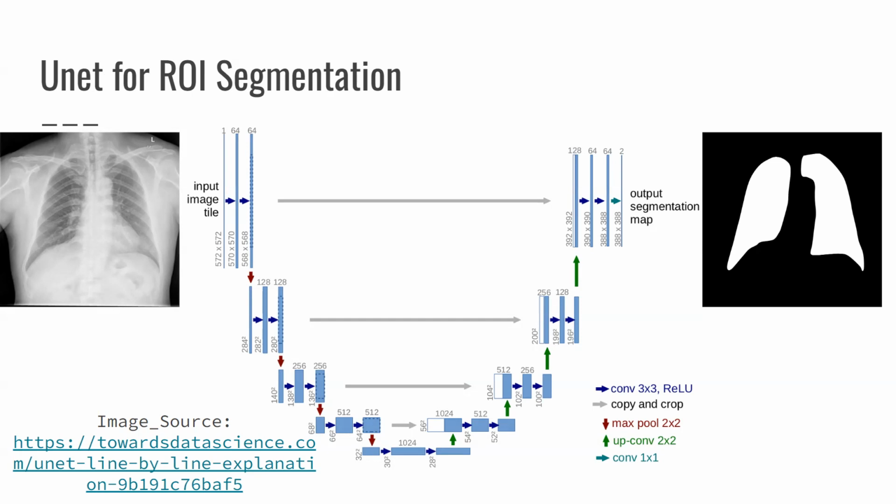So this model is made specifically for this sort of case. You see this UNet goes in, takes the input image, shrinks it down to a small representation at the bottom with a deep encoding, and then it expands it back up with skip connections and reconstructs the image into a binary mask. And this is the model that I trained to segment the pneumonia positive images.